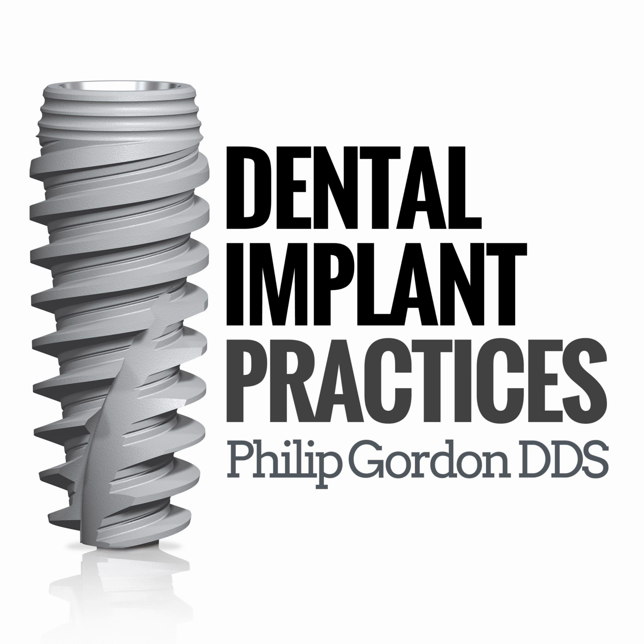And then for the final restoration, you want to look at stock abutments. Is a stock abutment in the posterior okay? Can your lab modify a stock abutment? Or are there titanium abutments, UCLA gold ones, that can be cast up? Can your lab make a custom titanium abutment, or are there, in the anterior zone, zirconia abutments going on top of the titanium? Titanium can be anodized for the gold hue, and then there are also the Zest attachments and the multi-units for fixed.